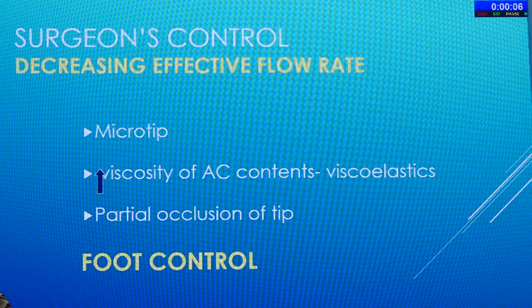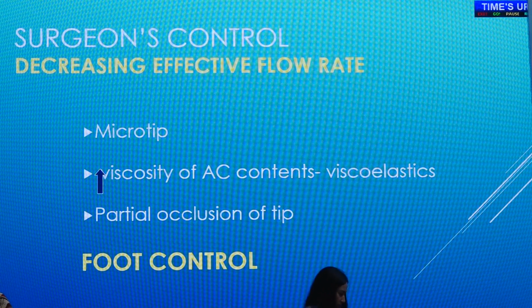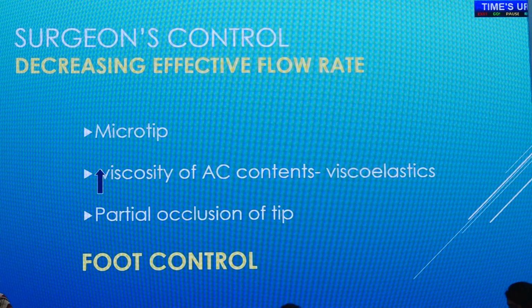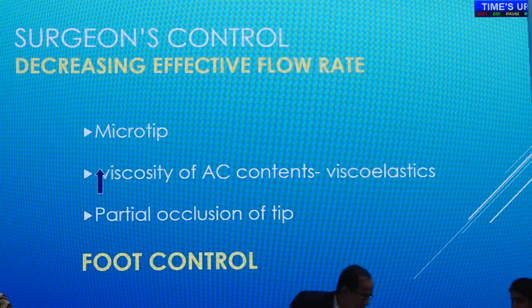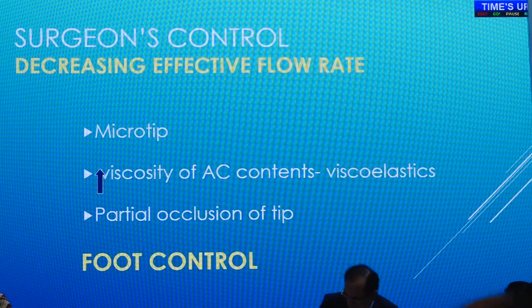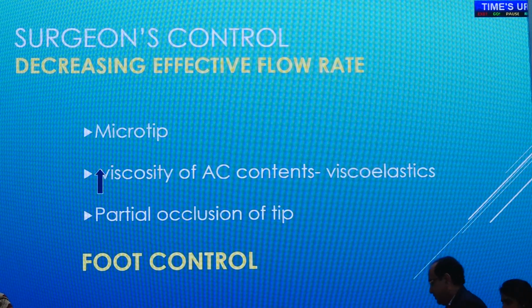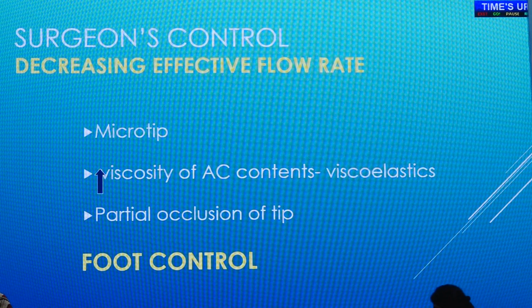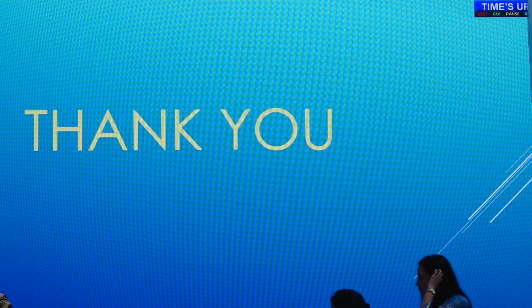Basically, all this happens when we have good foot control. As experience comes, we learn the proficiency of phaco. So basically, it is foot control. When we have good foot control, we can maneuver all this, where to keep the foot before the occlusion breaks, and how we can control this. So this is all I have to tell about fluidics and surge control. Thank you so much.